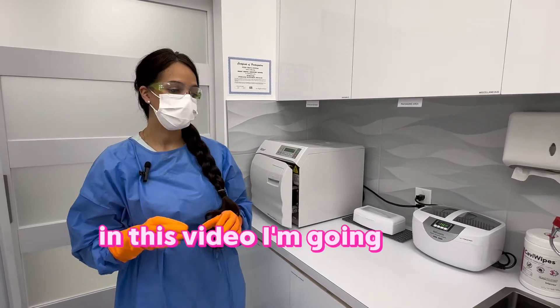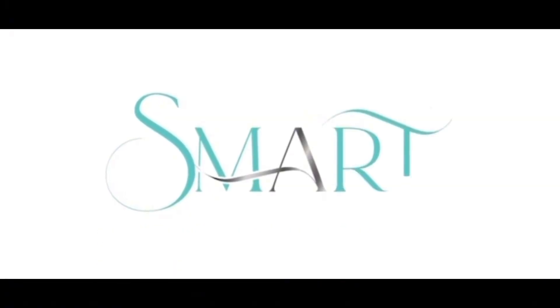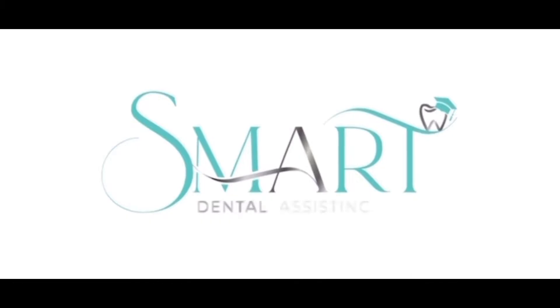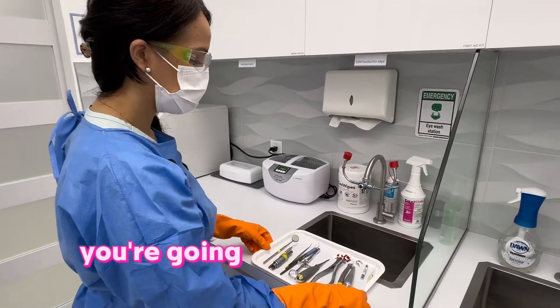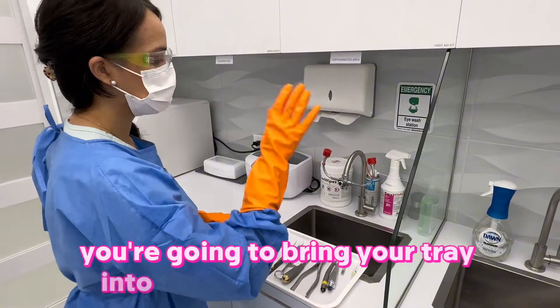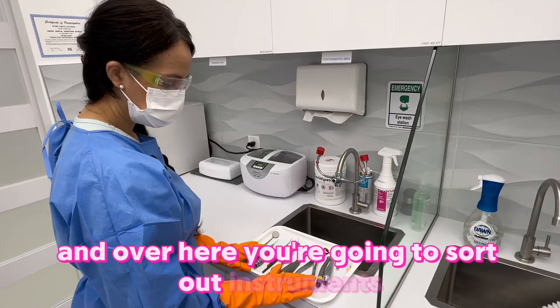In this video I'm going to be showing you how to process instruments. When you come to the sterilization room you're going to bring your tray into the contaminated area, and over here you're going to sort out instruments.